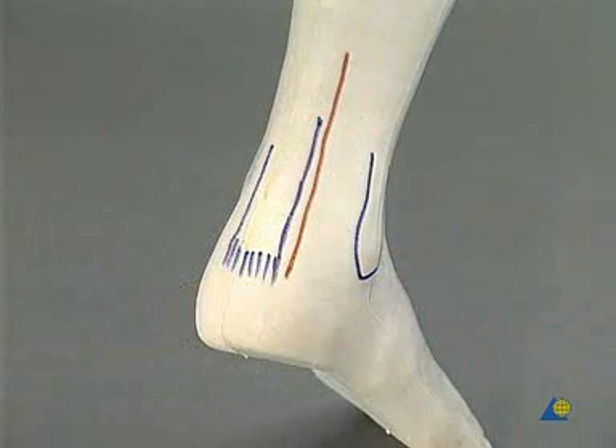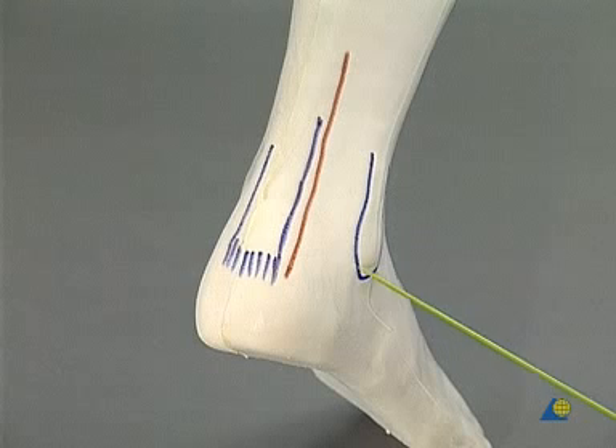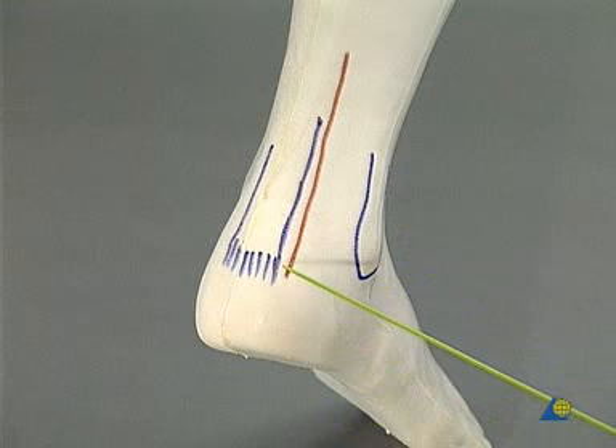A sterile tourniquet is placed around the thigh. This is the posterolateral aspect of the right foot. Here is the lateral malleolus, and this is the heel cord.